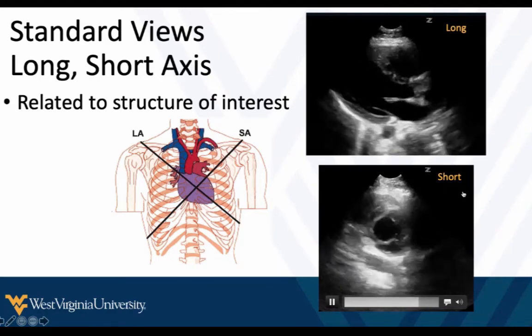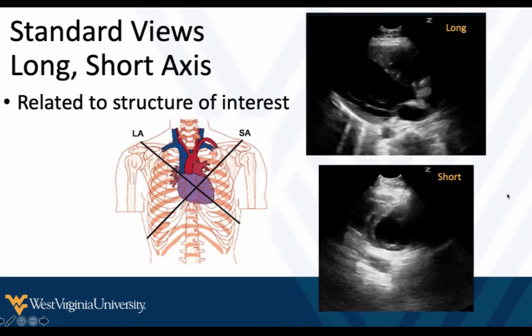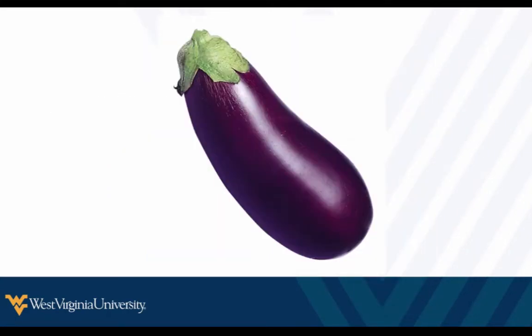So long and short axis may be something else we do rather than just a standard sagittal or transverse image of the patient's body. And just in case you like emojis, this is the example I use for some of my other learners, is long axis and short axis.